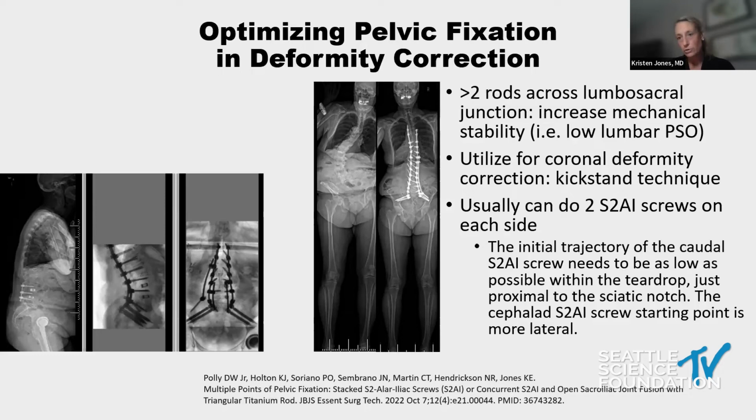One thing that's crucial, of course, is to lock in the lordosis that you create prior to distracting across your kickstand rod, or you'll distract out the lordosis you created. So that's just something to emphasize. And again, this particular patient has 5 points of pelvic fixation without a problem. Certainly plenty of room.